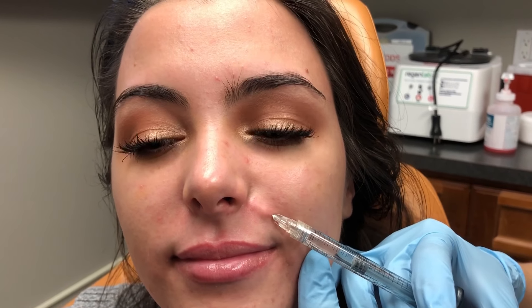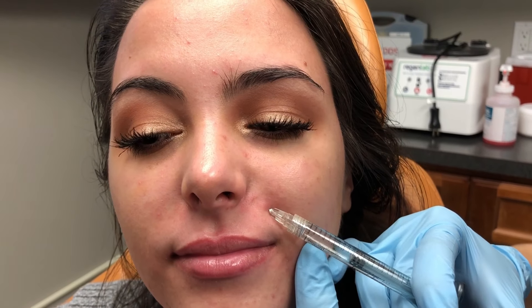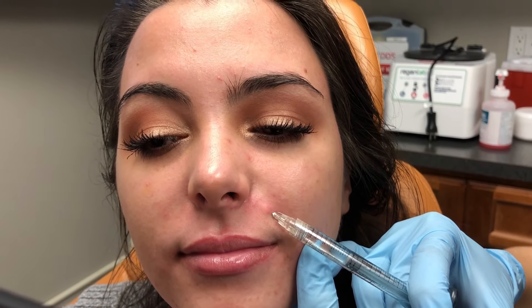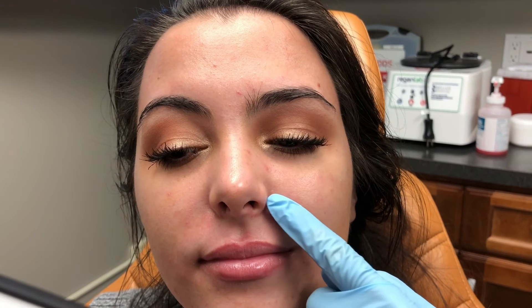I am going to fan over. I always want to know where that needle tip is, so I'm going to tent up again and do another slow retrograde here, then come completely out on this one. You can already see that it's starting to fill in this area, so I'm going to continue down her nasolabial fold.